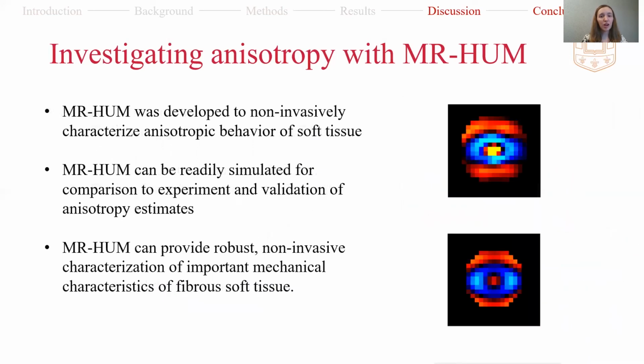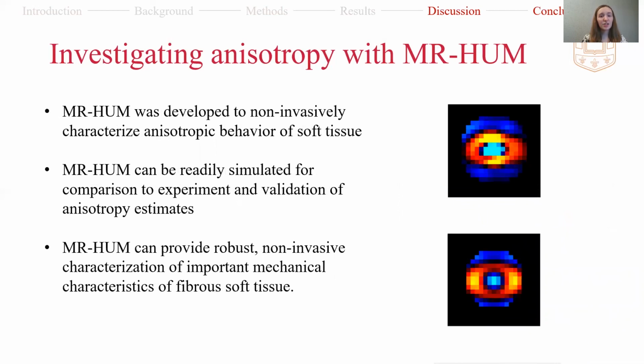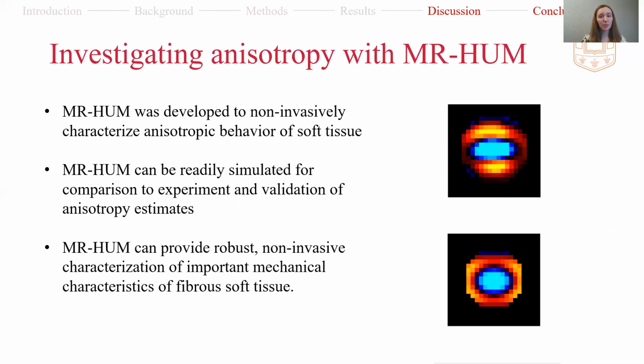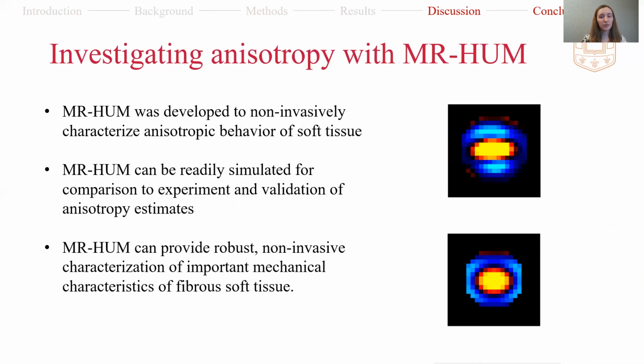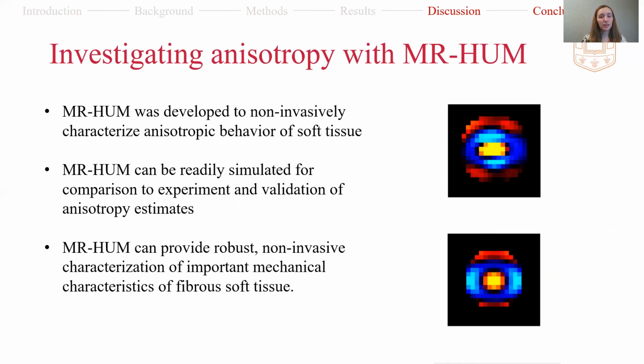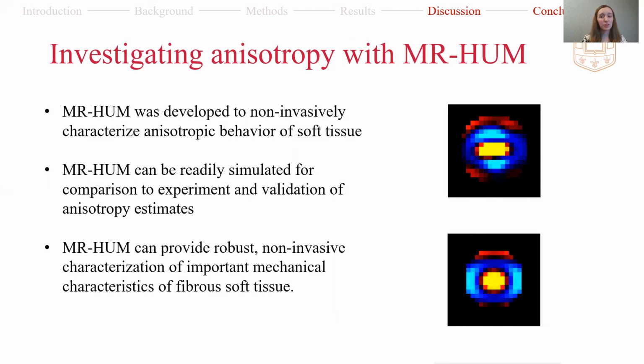In summary, MR-hum was developed to characterize anisotropic behavior of soft tissue. It is a non-invasive and non-destructive method that produces simple but rich shear wave fields that can be analyzed quantitatively. It can be readily simulated for comparison to experiments and validation of anisotropy estimates. This novel method can thus provide robust, non-invasive characterization of important mechanical characteristics of fibrous soft tissues.